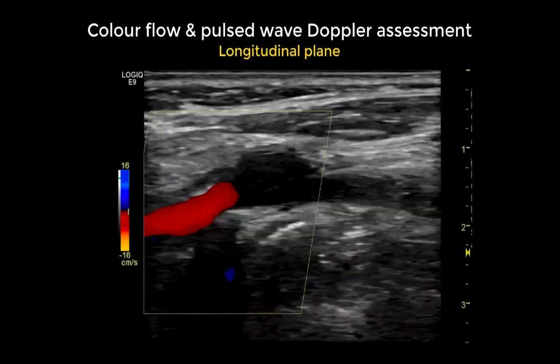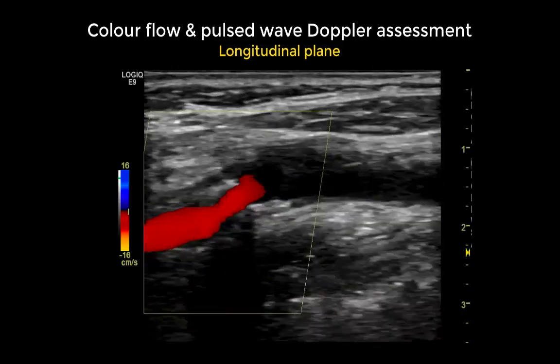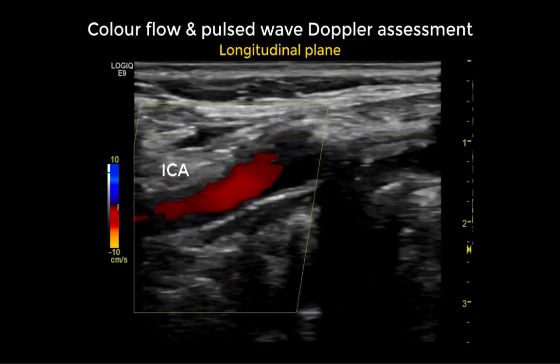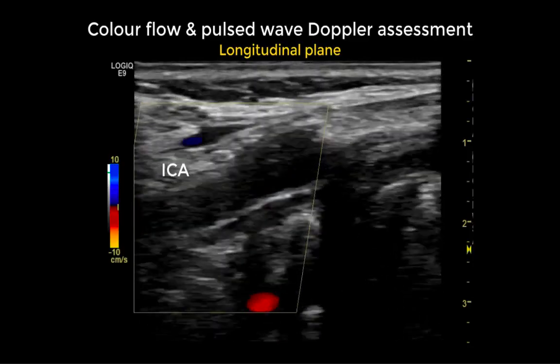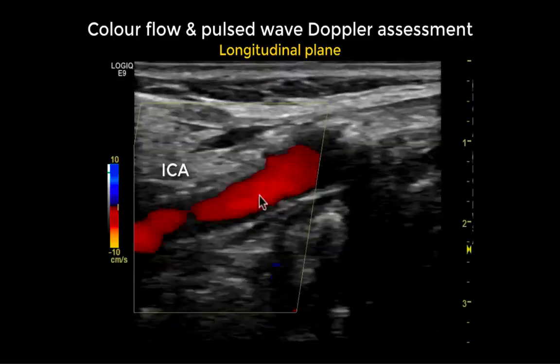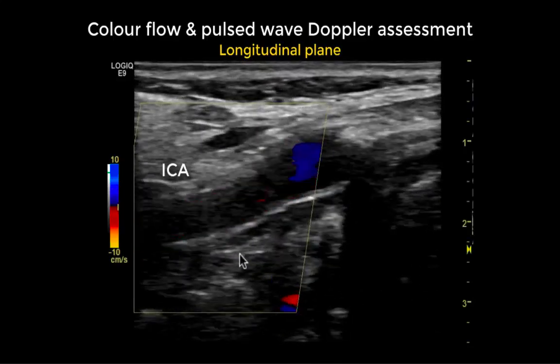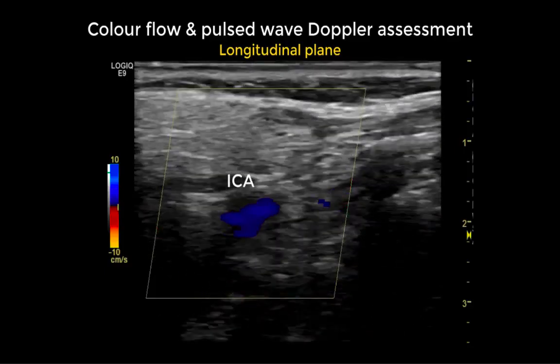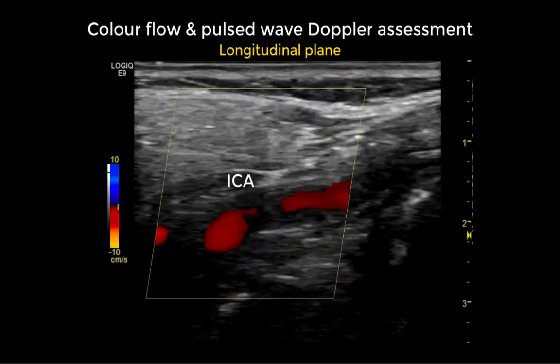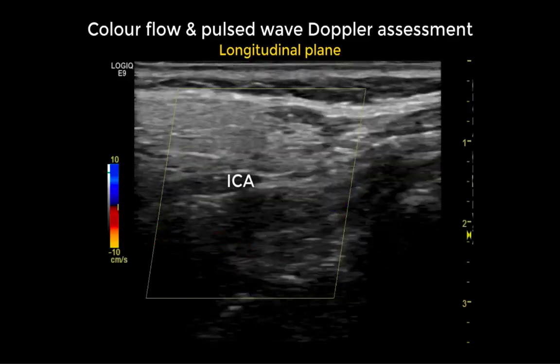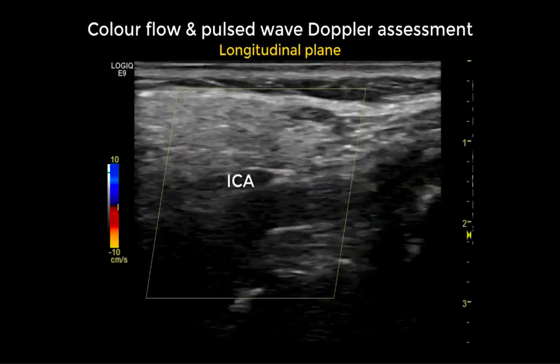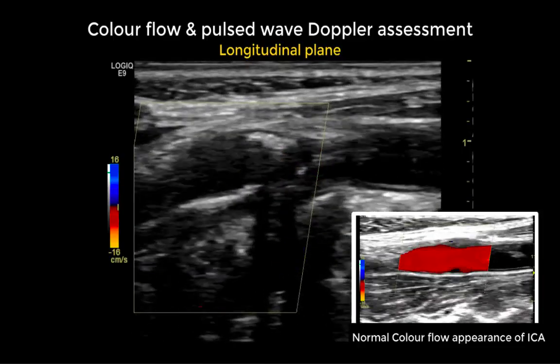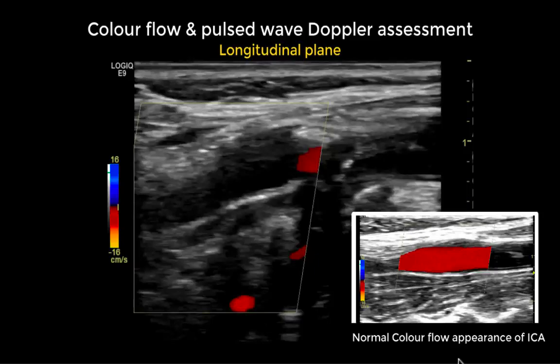We now continue the assessment into the internal carotid artery. Using colour flow within the internal carotid artery, we note that there is no complete filling and the colour pattern is alternating — with red and blue patterns visible. Since the brain is normally a low resistance territory, these alternating colour findings are suspicious of distal obstructive disease.